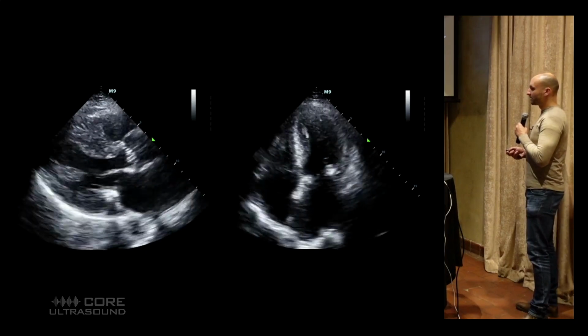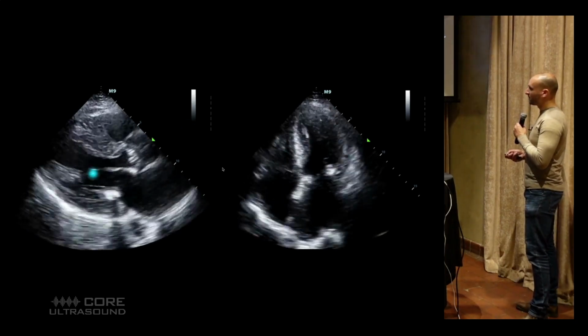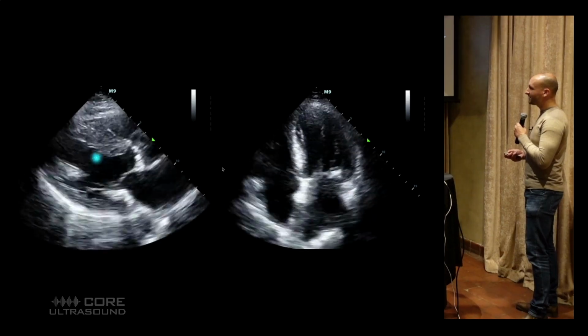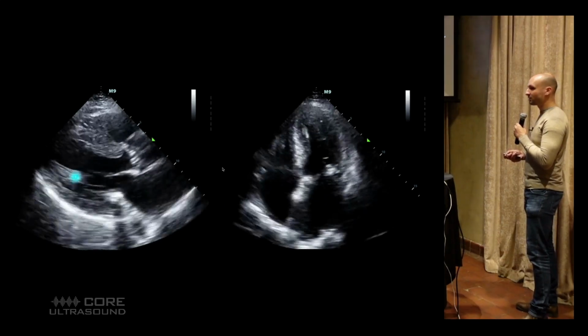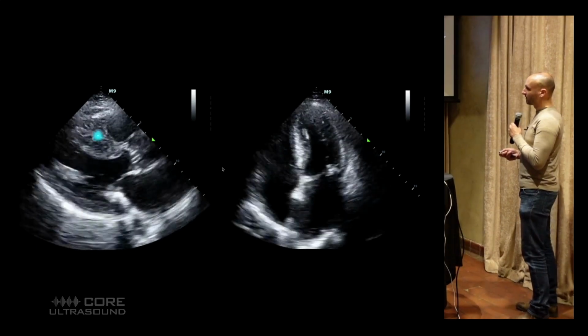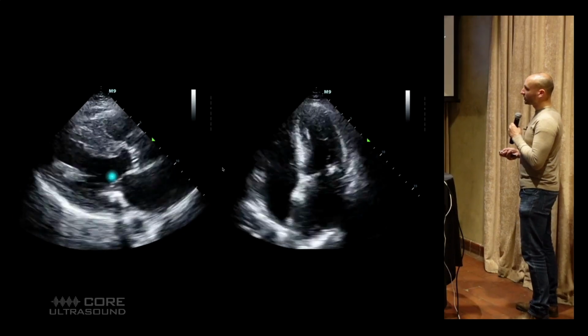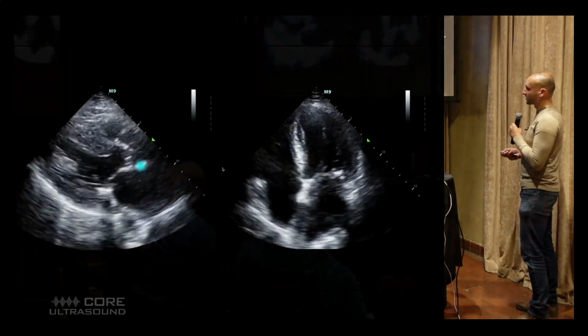Here's another example here. This is a good example of aortic stenosis. So if you see here the mitral valve, it's going up and it's very nearly hitting that septum. We have good excursion here. We probably have some diastolic dysfunction here based off of how thick the walls are and how big that left atrium is. But we'll look at this, good excursion. We look here, very poor excursion.